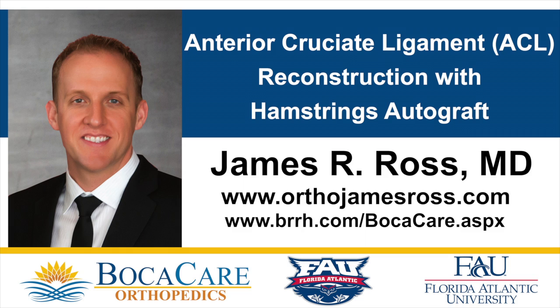This video demonstrates an anterior cruciate ligament reconstruction using a hamstrings autograft. The patient is a 16-year-old female who sustained an anterior cruciate ligament tear while playing soccer.